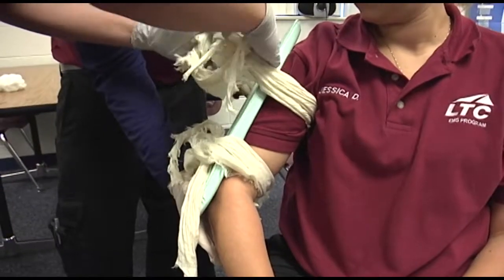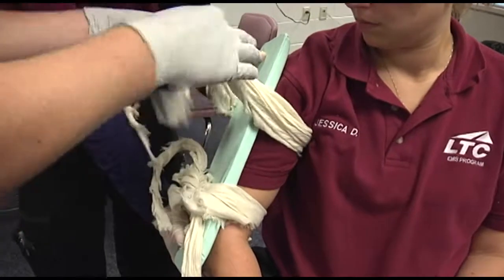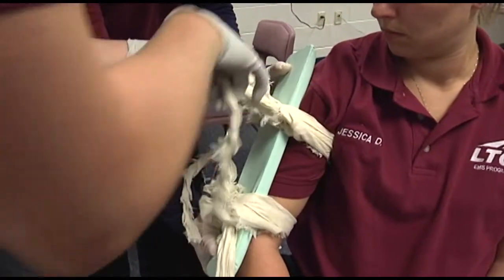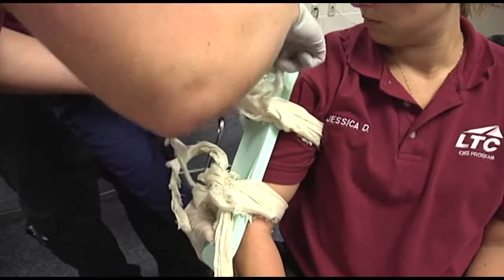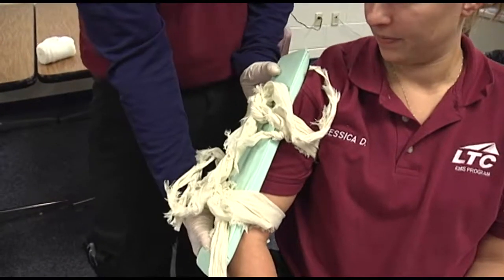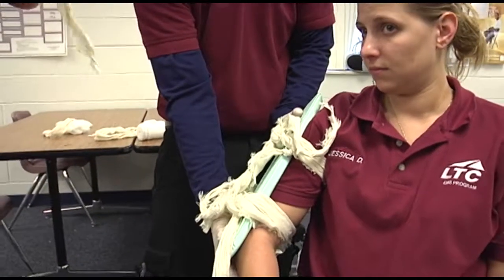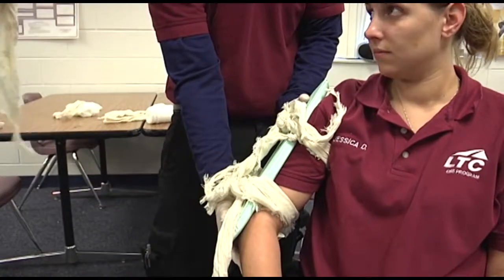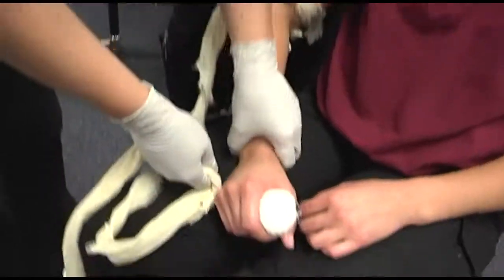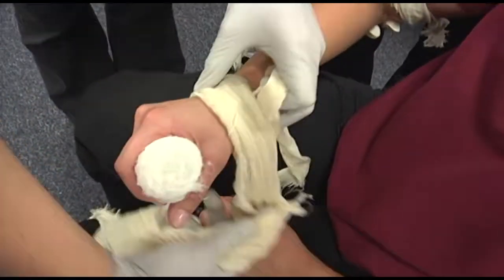Place a padded rigid splint on the lateral aspect of the arm to maintain alignment, and secure with a bandage or cravats, tying the cravat to the board. Apply a wrist sling and swath to the injured arm to hold the arm in place.